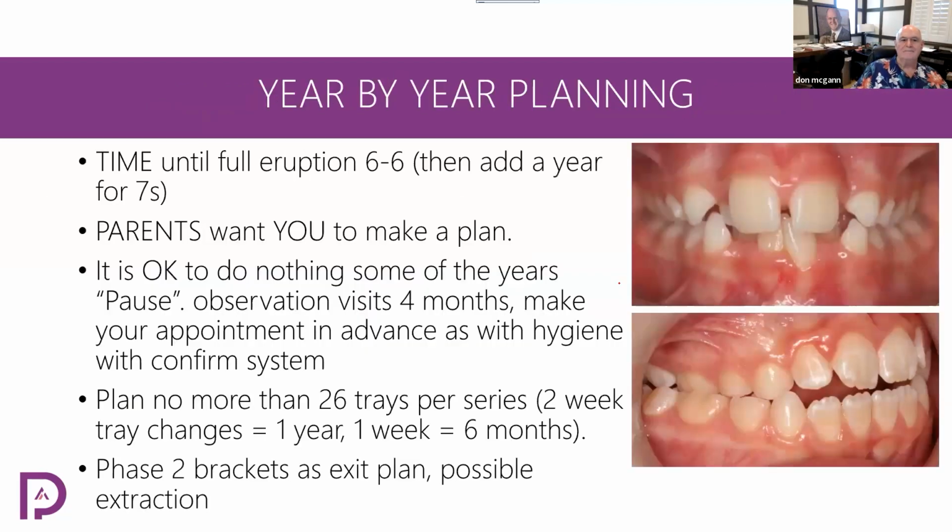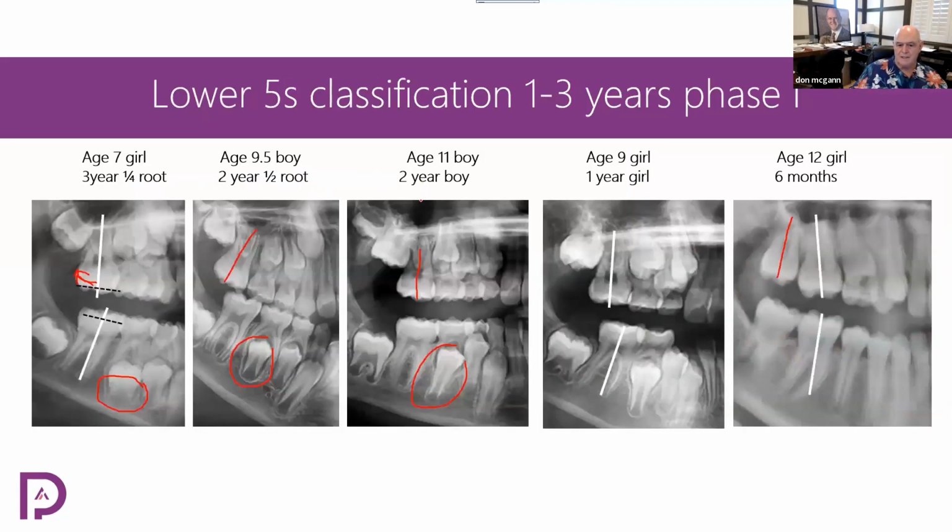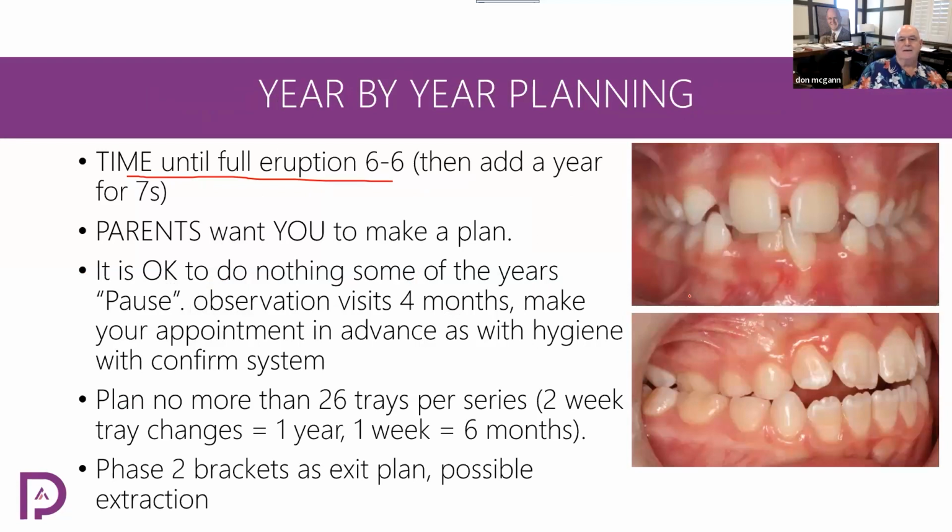And if you want more, you say change the distal rotation from 10 degrees to 15, and they'll do it immediately. Okay? So year by year, we're gonna estimate the time until full eruption based on what? Based on this. Based on the lower 5 root formation. That's been in place for, I don't know, 30 years now in POS, okay? Been a long time I've been doing that. So you're gonna have eruption of 6 to 6. That'll be the start of phase 2. Half of them may have the 7s erupted, half of them don't. Okay? All right? So you say, give me a year's worth of trays, then I'm going to make a refinement, and we're going to include the 7s.